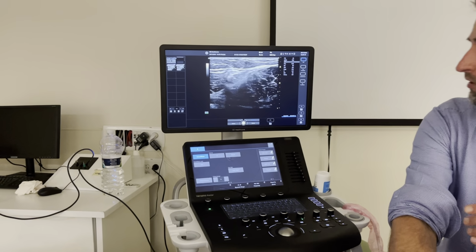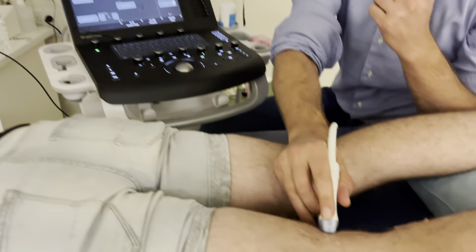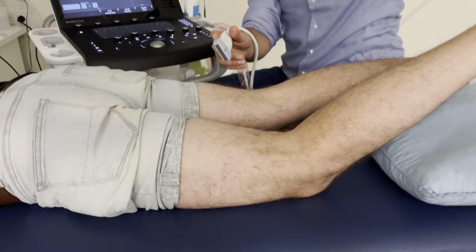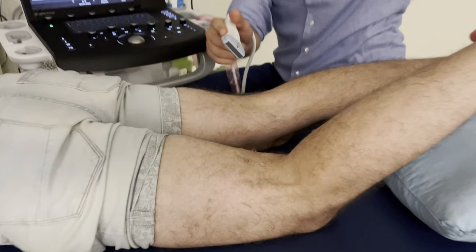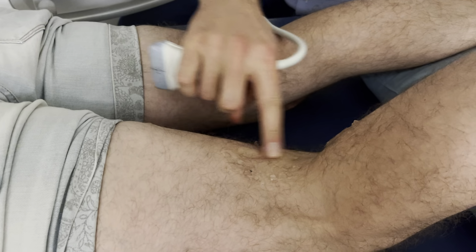So mostly what happens is that people start scanning and they don't scan here, but they scan more here. And there you can see a tendon as well, but that's the gracilis tendon, and they think that that's the tendon of the semitendinosus. So we need to scan it more on the dorsal side. If you have any doubts, just ask the patient to hold the foot up, give a bit of resistance. I palpate, you can actually see it here. This is the semitendinosus tendon.